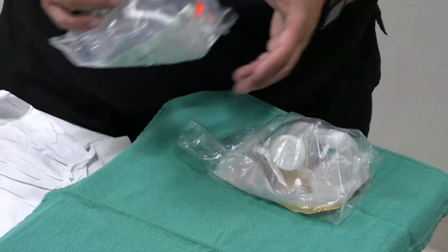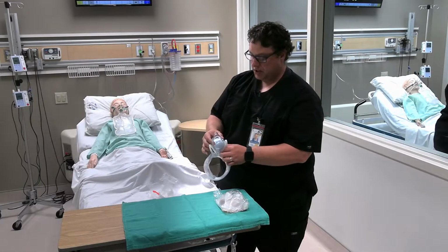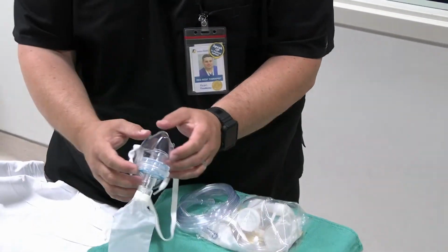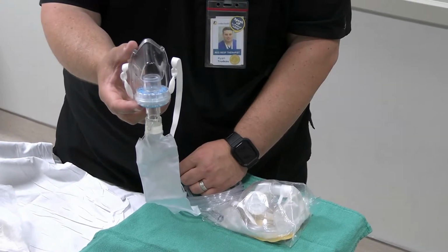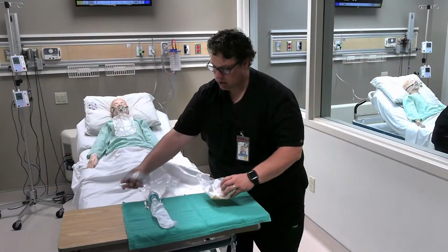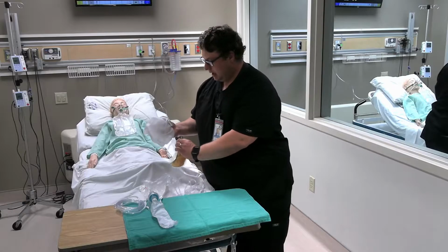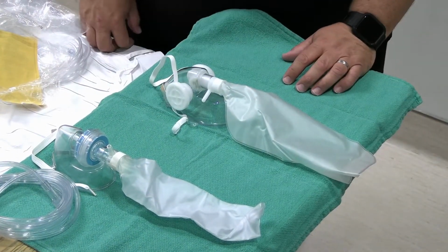Or we also have another filtered non-rebreather. The filter is actually attached to the inspiratory port of the reservoir bag here. So this is another type of filtered non-rebreather mask that's available on the market. And then there are valves that are replaced with filters on this type of device here.